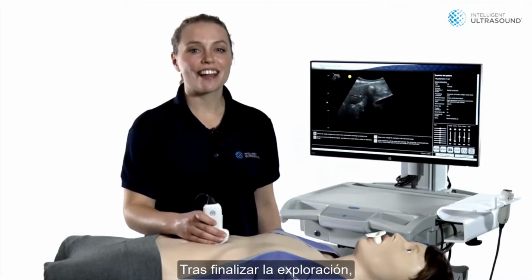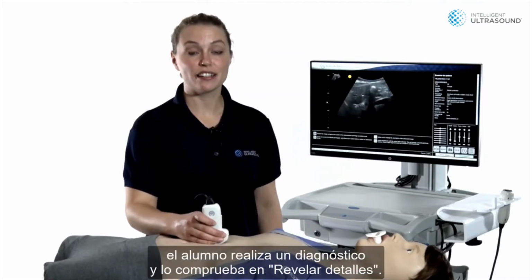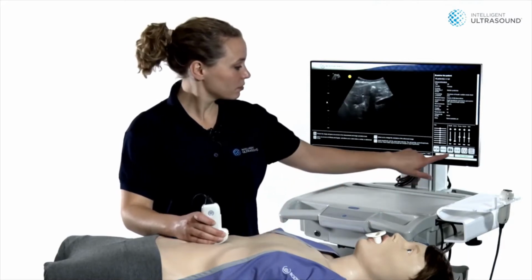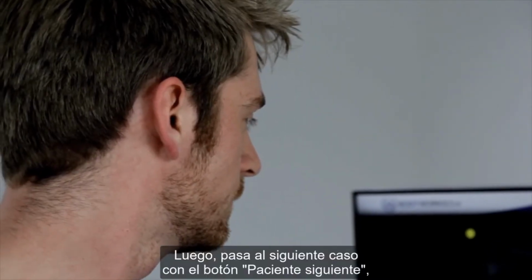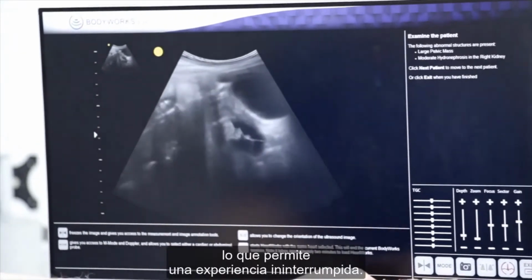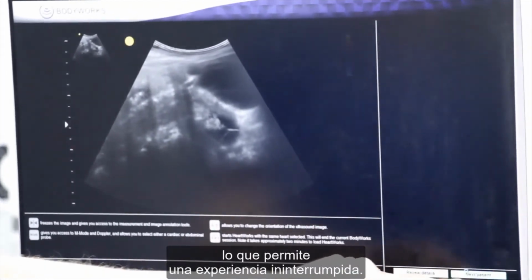Once the trainee has scanned the case, they make a diagnosis and see if they were correct by clicking Reveal Details. They then move to the next patient case in the list by clicking the Next Patient button. This loads the next patient case without leaving the software, enabling a seamless scanning experience.